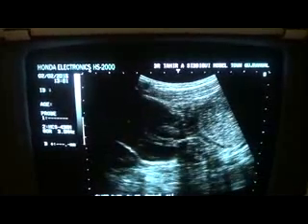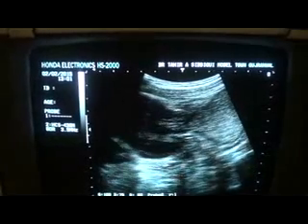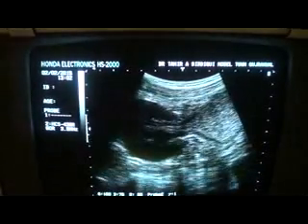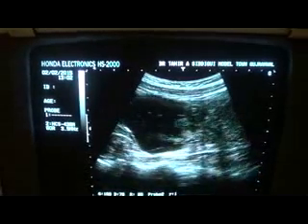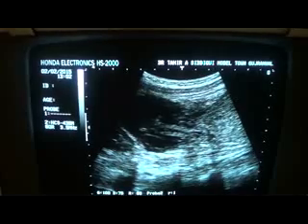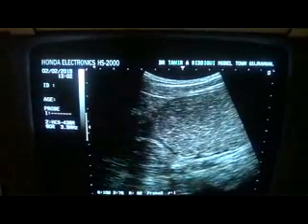Now you see, this is the lumen of the bowel of this segment protruding into another bowel segment. Here you can see. And now you can see there are very few peristaltic movements.